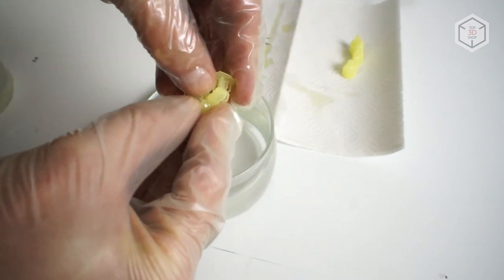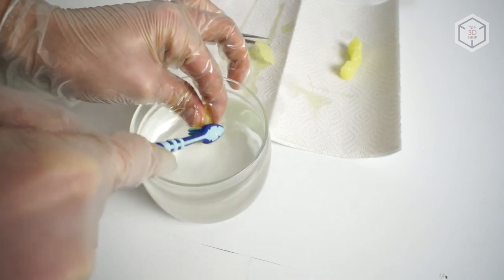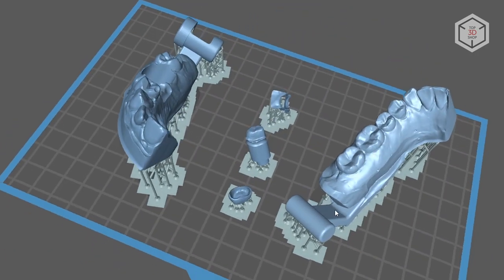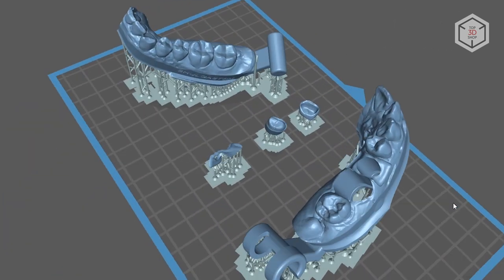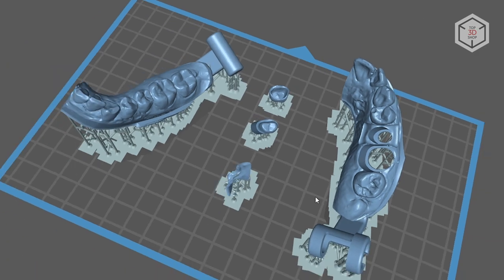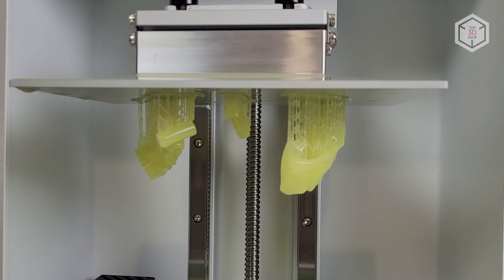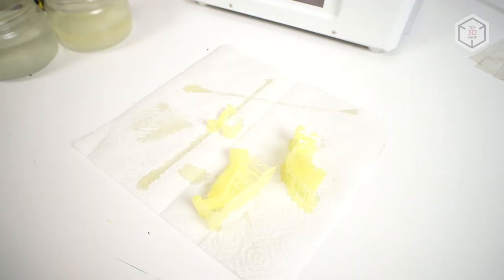After the print, the models were rinsed in isopropyl alcohol, and with the supports removed, placed for post-curing under a UV light. While the first batch was curing, the following models were launched for printing with the same resin. These are jaws in 2 parts, with the lower jaw incorporating openings. A tooth and a crown designed to fit in one of the openings were printed separately, as well as a small gum pad. We chose to place the parts on supports due to the complex geometry and for best results on the mounts that should connect the 2 parts with as few traces of supports as possible at the junctions.